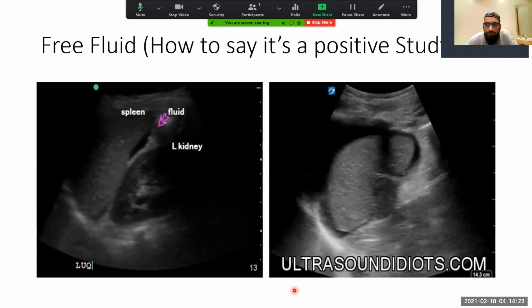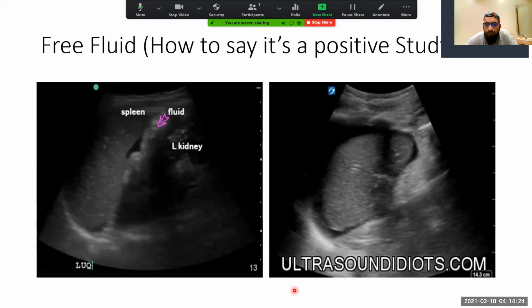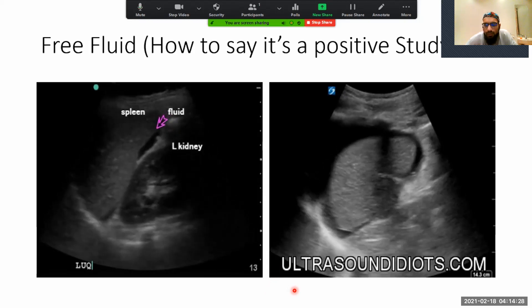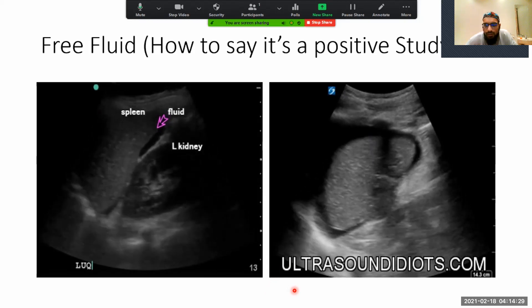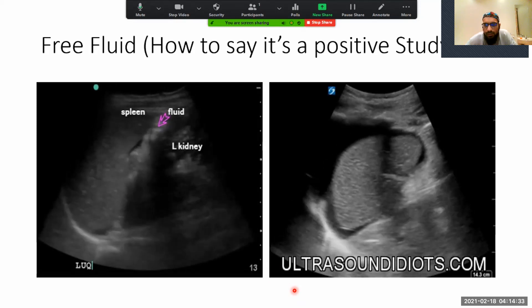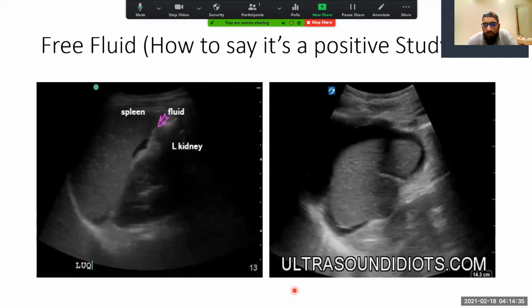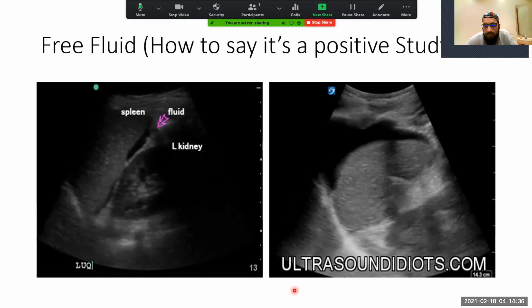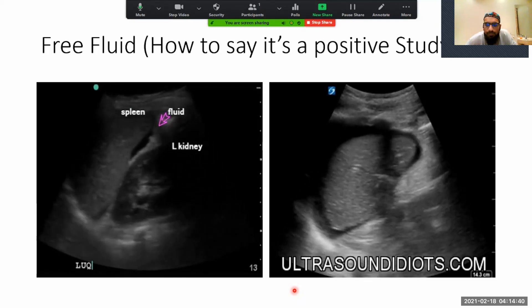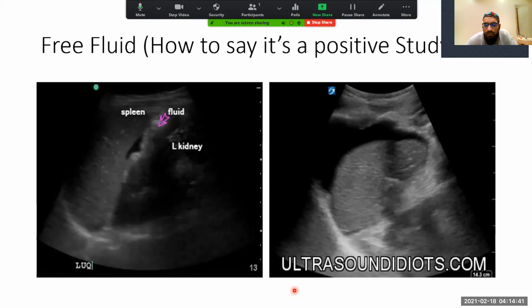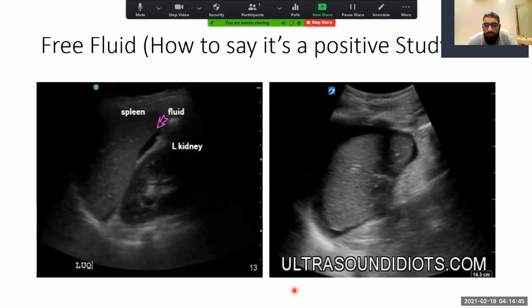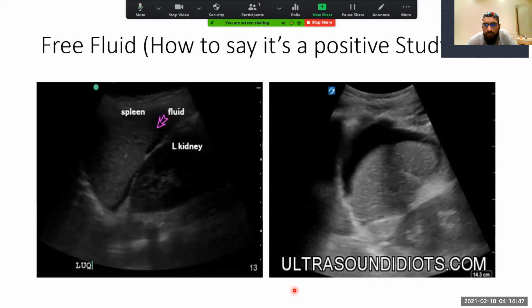With the FAST exam, we want to show as much evidence as possible to the surgeon that this is serious. When we're looking around the spleen and suspect a splenic injury — or even free fluid from somewhere else — because the spleen has the potential to bleed so severely, we really need to look for it.